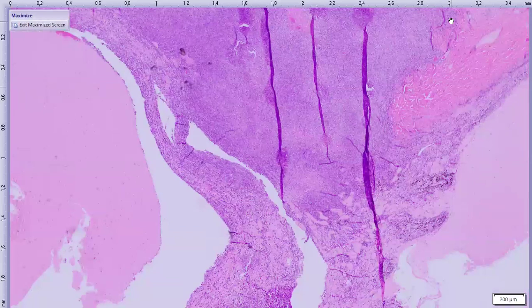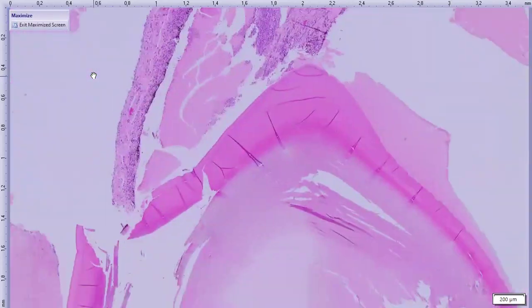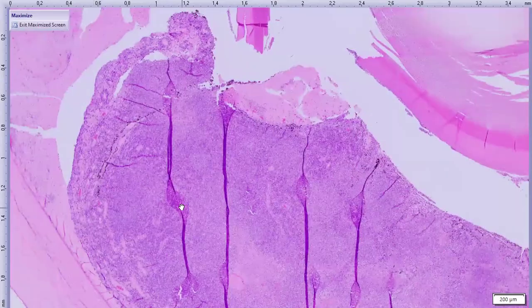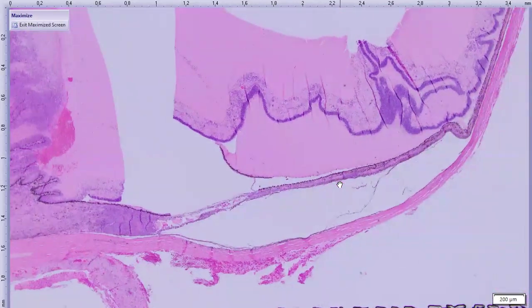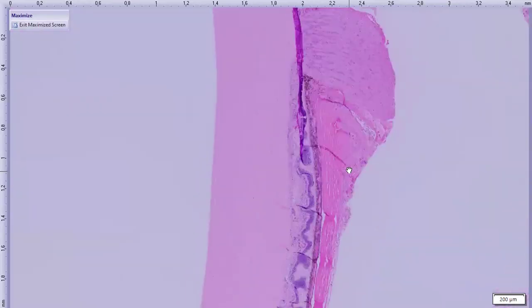It extends out into the limbal sclera here, causing the bulge. We'll go over this side. We can see that it's expanding and effacing the ciliary body. Here's some squished plica. It's free in the vitreous. It comes back, not quite as florid in the choroid, but there's a little bit of cellular infiltrate here as well.